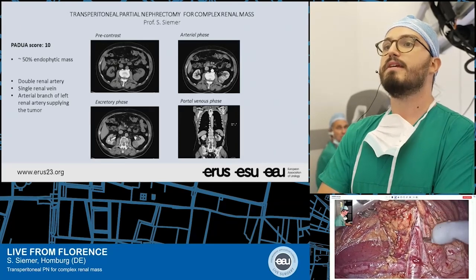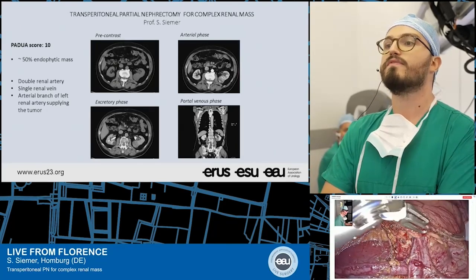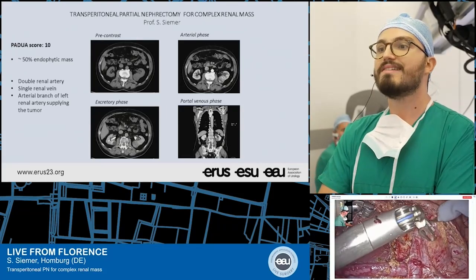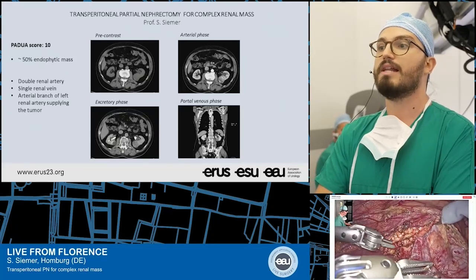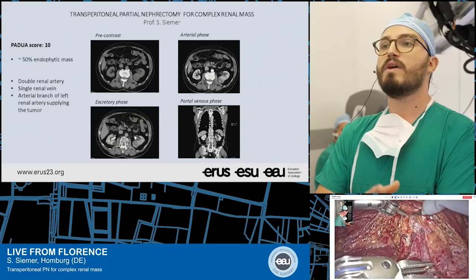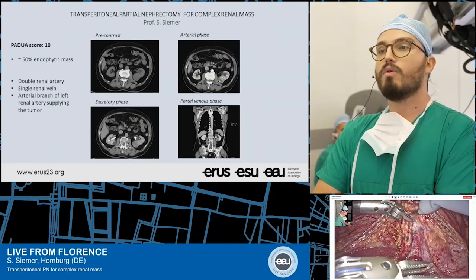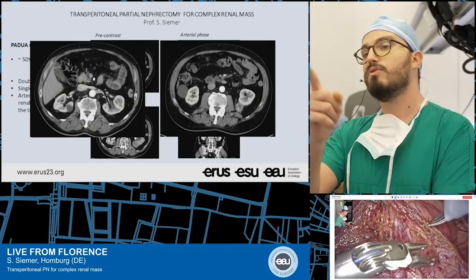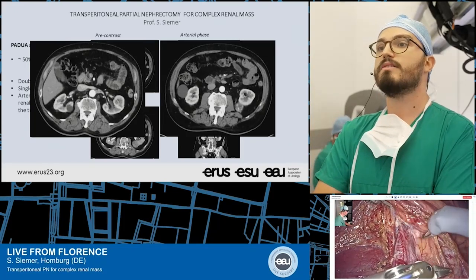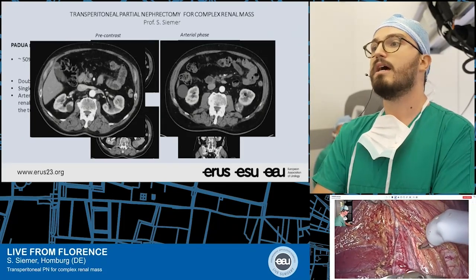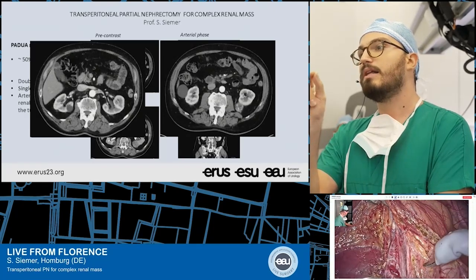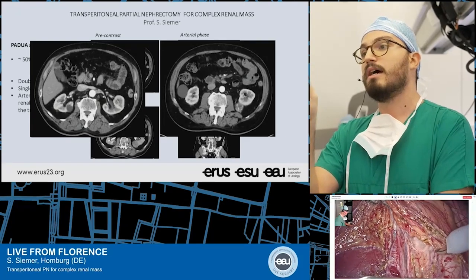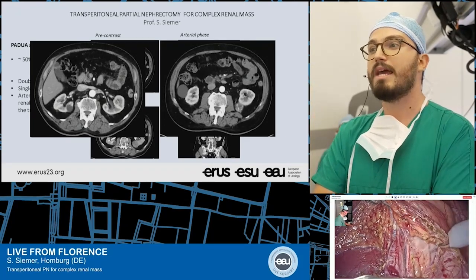It is a 50% endophytic mass with a Padua score of 10, in close contact with the collector system and the inferior posterior calyx. Looking closely at the vascular system, we can see two renal arteries and one renal vein. There appears to be a small branch supplying the tumor — it might be a venous branch.